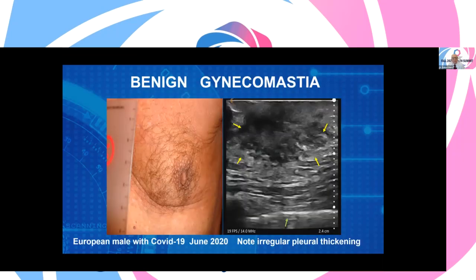All right, benign tissue, very common. So people are worried. What is it, doc? And we say, well, you can see it's a big area, but it doesn't look like cancer. It didn't show up as cancer on the other things. This is the common type of benign male breast tissue, which is occurring in men because as they go on high blood pressure treatments or cholesterol treatments or any of the new treatment technologies they're getting, they often develop benign disease.